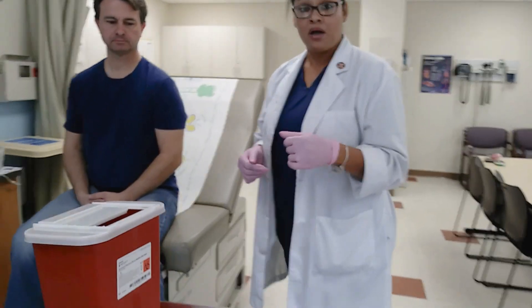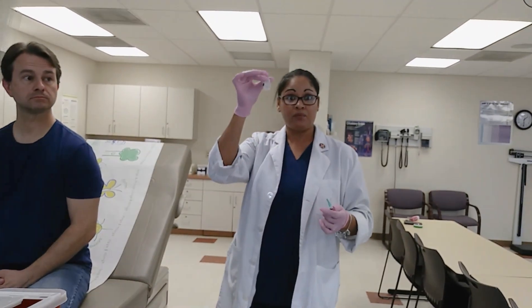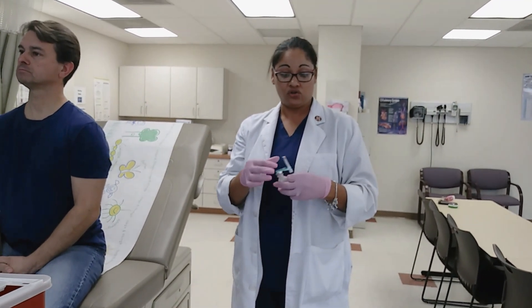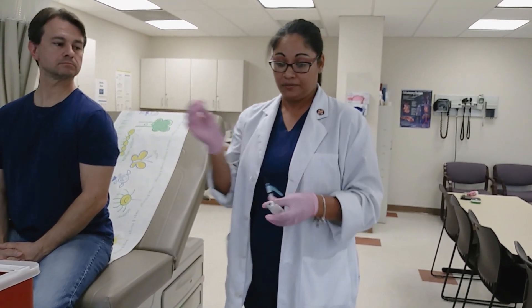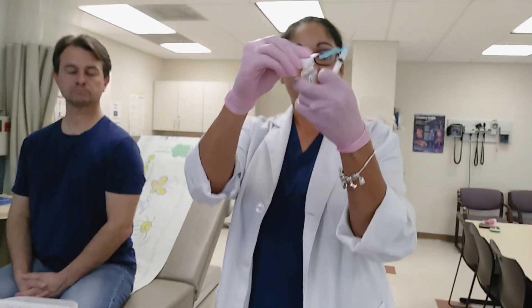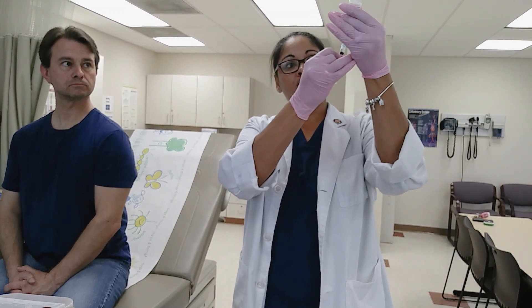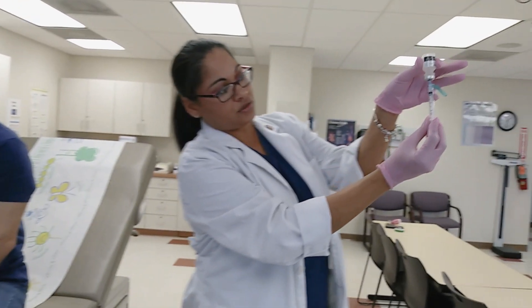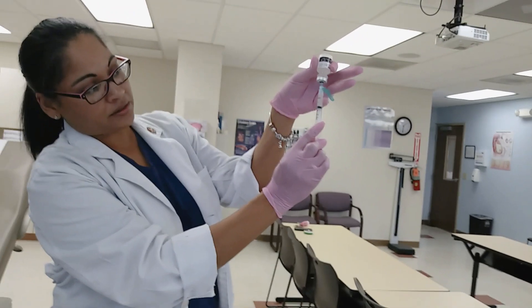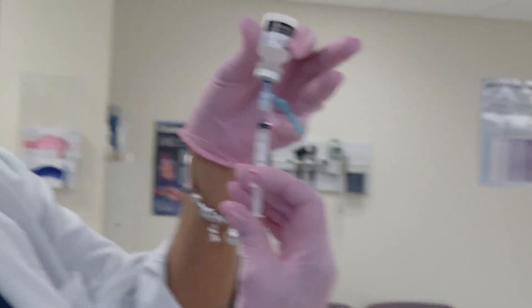I'm going to draw 0.5 mLs. I've taken the medication out of the cabinet, compared it to the physician's order, and now I'm ready to draw it. We're going to clean the top of our bottle with alcohol, pull down 0.5. I'm going to inject 0.5 of air and then pull back down — I like to pull down farther than needed to get those air bubbles out. I have absolutely no air bubbles in there now.